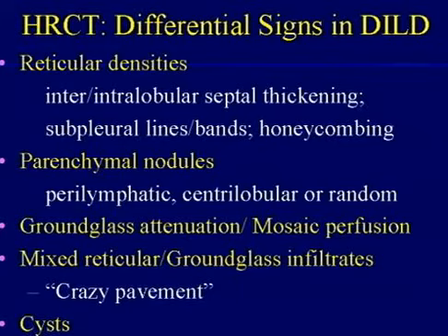And so it makes a lot of logical sense that we'd look at thicker sections and occasional thin sections, but the computer would also then look at all those thin sections. And it's not just for lung disease, it's really for everything.